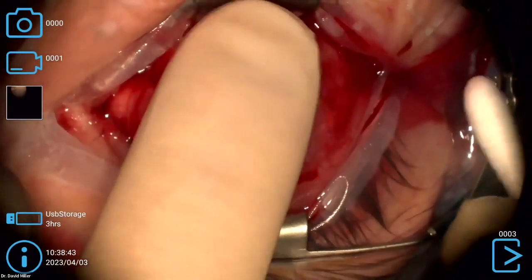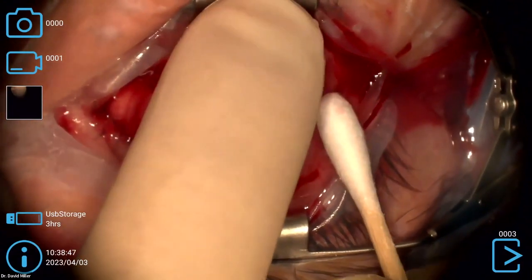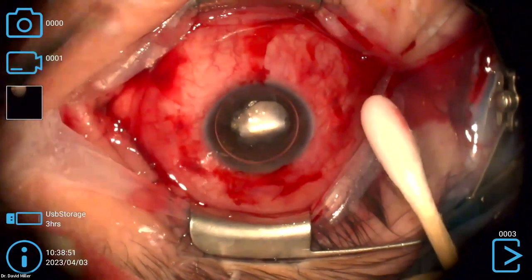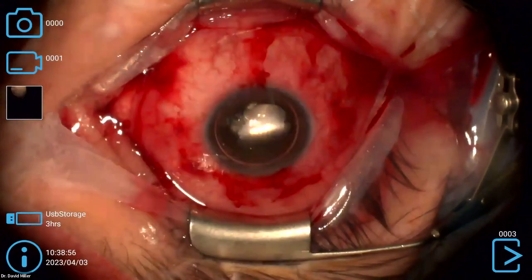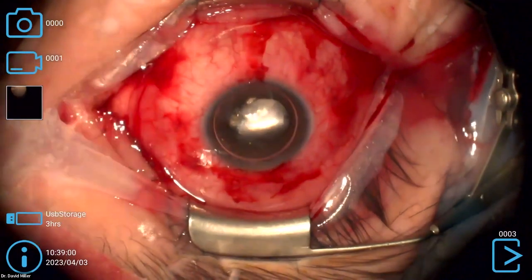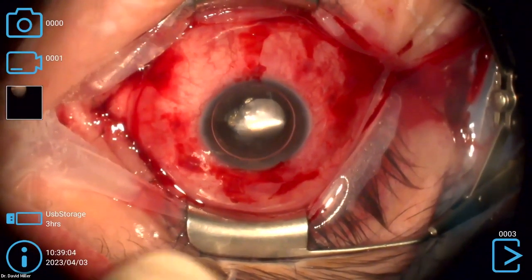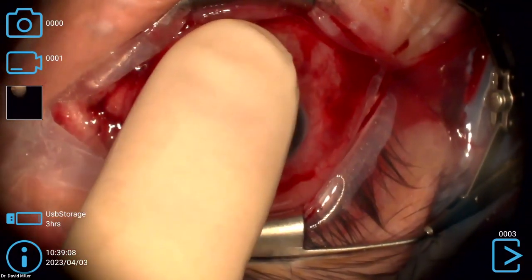And it's doing great. Eye's very firm, actually. Probably a little too firm. Yeah. Well, we're going to have to, yeah, probably going to have to pull a little gas out. We're a little firm. So we did get it to close. We're just going to take a little bit of gas out, and we're going to just soften the eye a little bit.